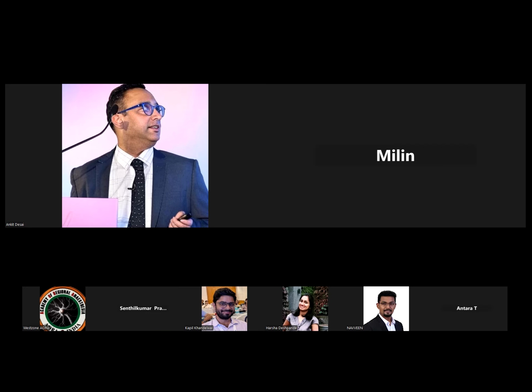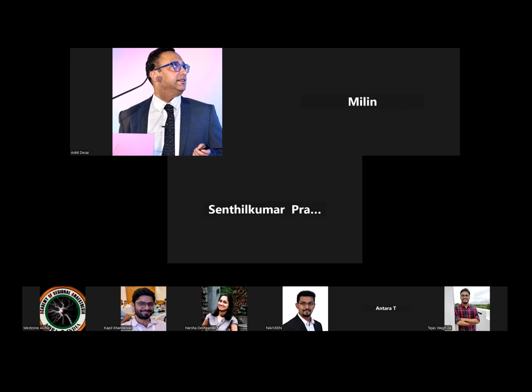Just wanted to pass a comment. Lumbar sacral plexus blocks are reserved only for high risk cases nowadays. It's not a routine block, and it is used, I think, only for giving anesthesia. It's not an analgesic block. Many a times the high risk patients are elderly patients, so there is no echo contrast as well. So you will have to be careful in using dual guidance, because there is no echo contrast and also intramuscular tendons. So you always need dual guidance to do the lumbar plexus block.